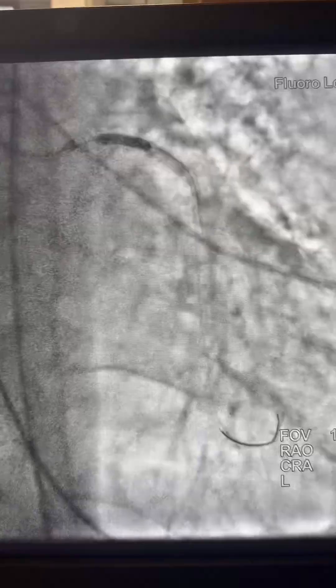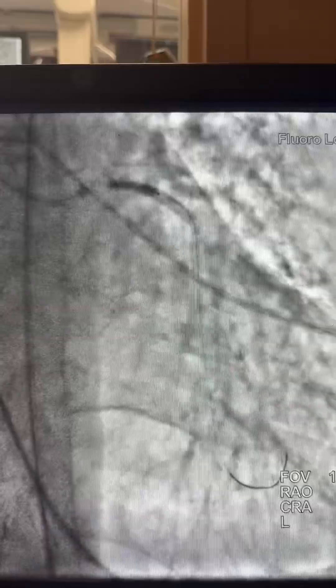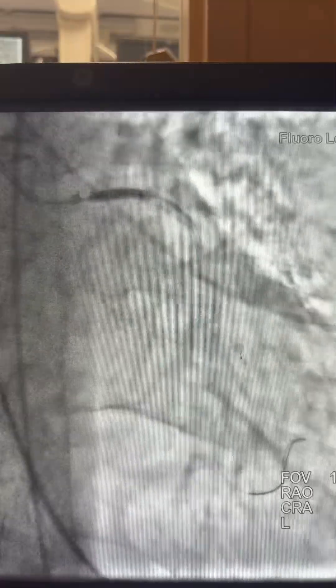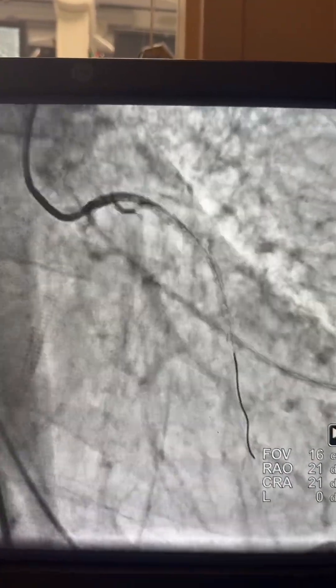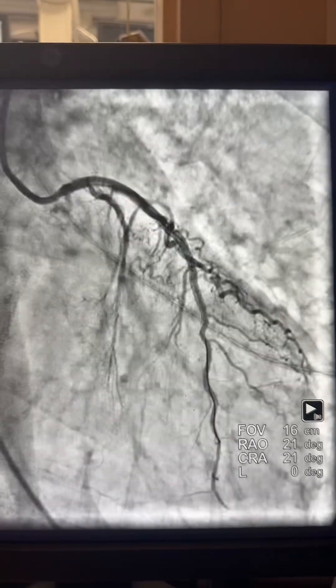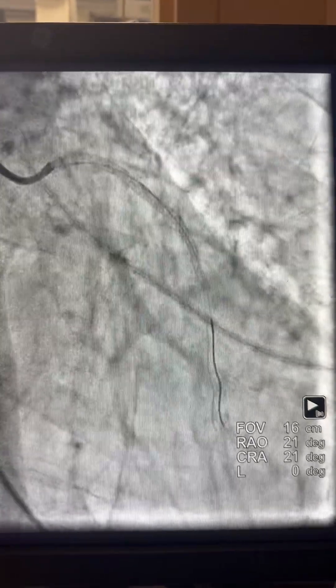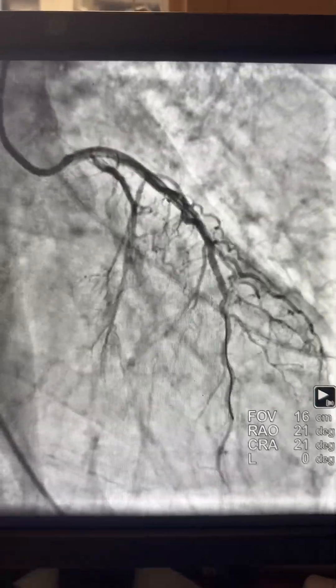Now that we've established flow, I perform fast high-pressure inflation for the LAD and left main stents. Here is the final angiogram showing the LAD and LCX.